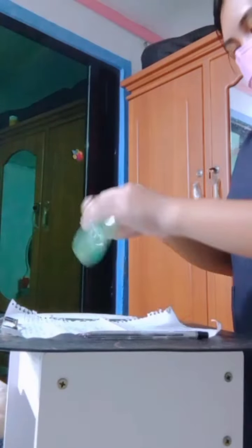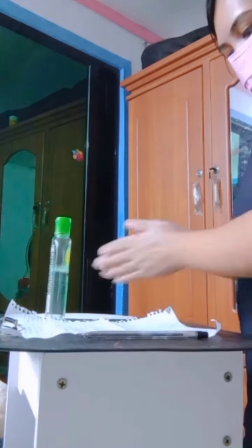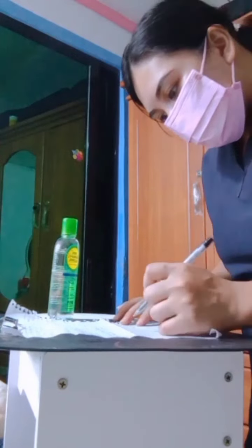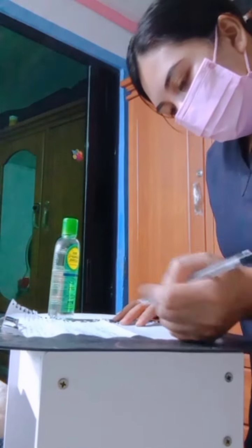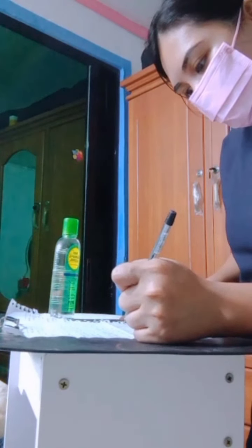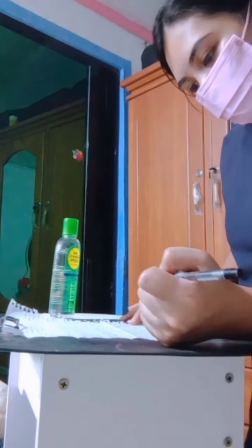Perform hand hygiene and document the procedure, including your pre- and post-suctioning assessment, the amount, consistency, color, and odor of the patient's secretions, the size of the catheter you used, and the patient's response to the care.